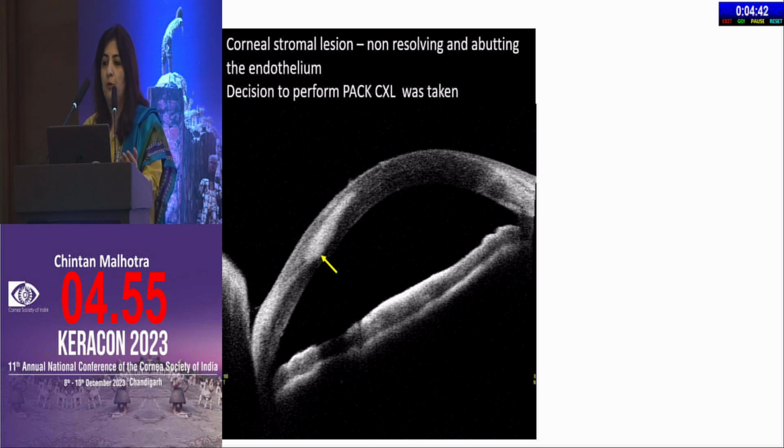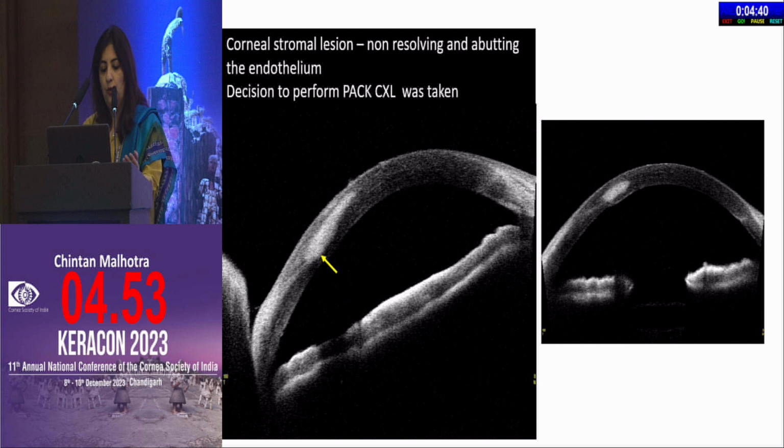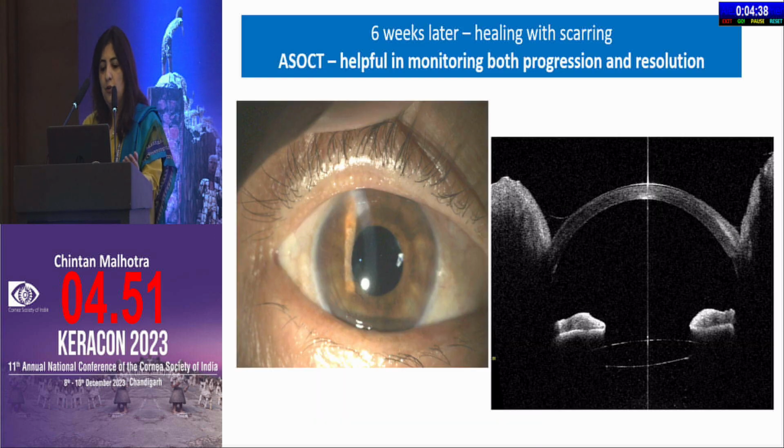So the decision to perform a PAC-CXL was taken. This is the original lesion. And so 6 weeks later, post PAC-CXL, there was healing with scarring.